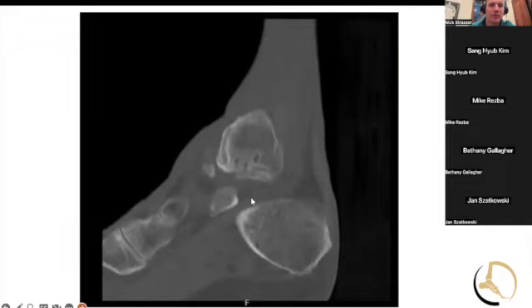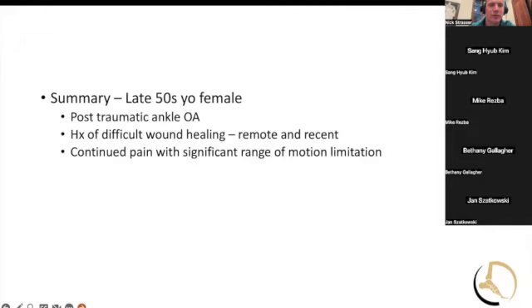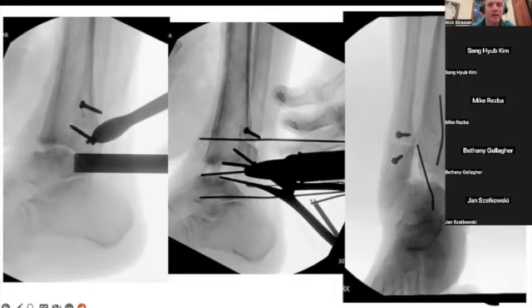So I went from the back. This is my little summary. I went from the back, and I did use a high-speed burr, I guess. I exposed it and cut the fibula between the two screws. I ended up leaving the screws because they were a landmark for seeing me close that down, because she was still in some varus. So I wanted to close that down. I think I took down some of her medial mal as well, but I was really trying to get that translated posteriorly. But like Bethany said, this ends up shortening it quite a bit by taking out that big posterior piece.